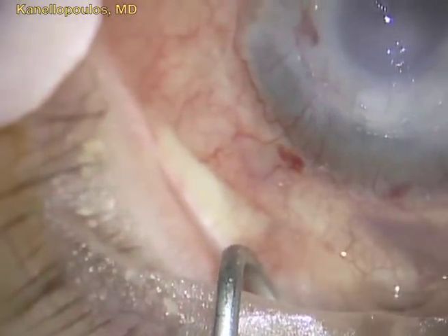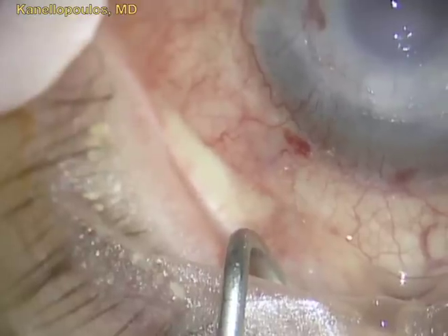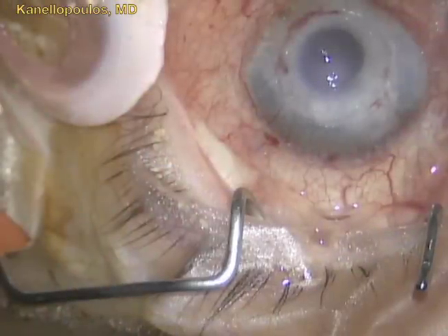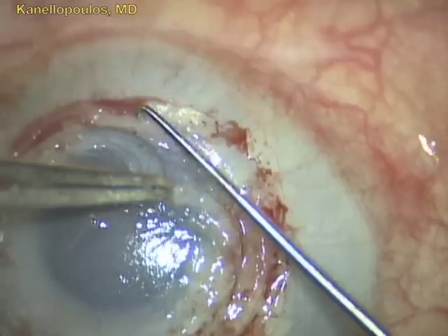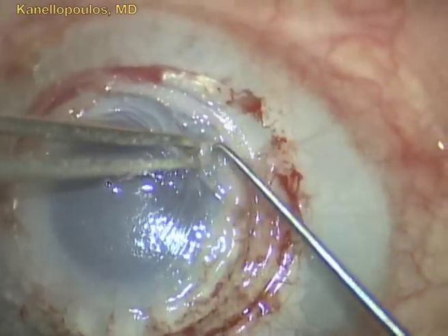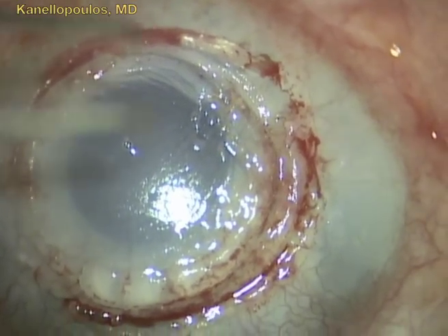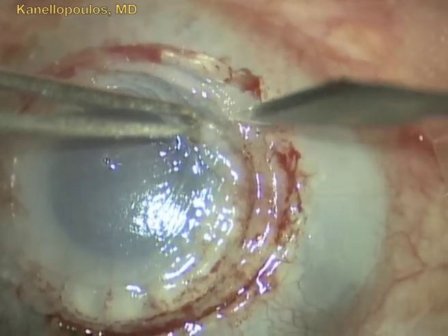We will go on to the host. We'll place the donor tissue in a storage Teflon vial with one drop of Optisol to keep it moist while we're preparing. As you can see here, we reached that step, which is also present in the host.